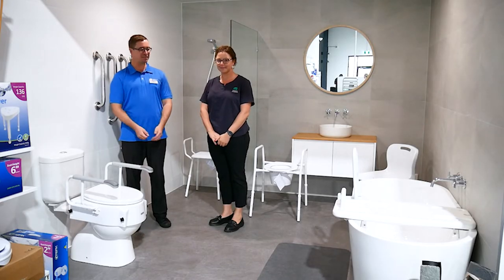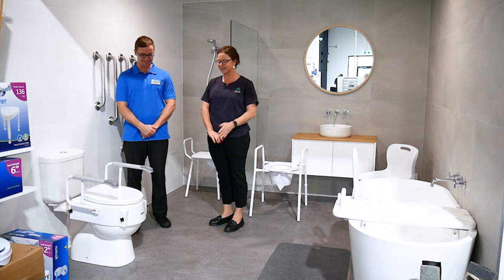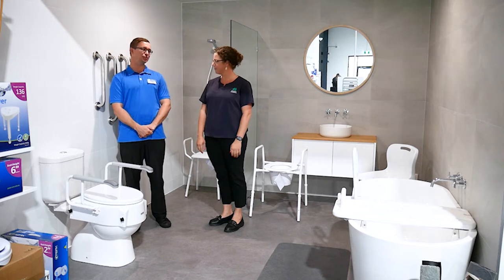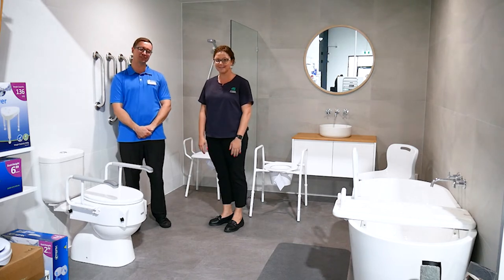We're at Anstey's today and I'm here with Bec. What have we got here in front of us? So we have an adjustable toilet raiser here. Also called the throne — some people call it the throne.